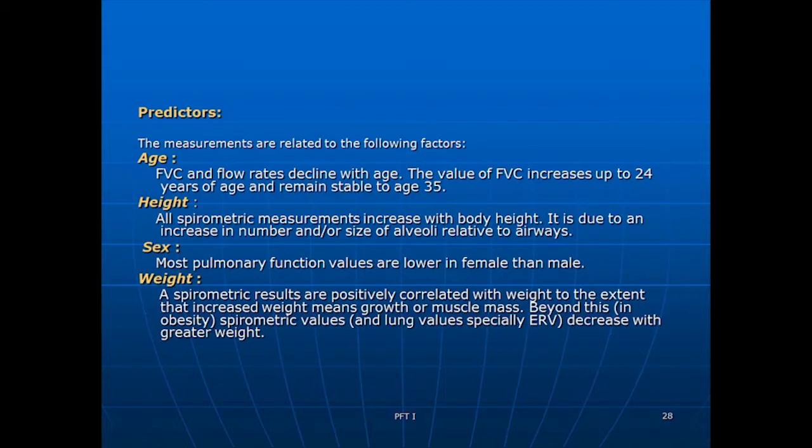Height, the taller you are, the higher your pulmonary function values are. Gender, males usually have greater pulmonary function values than females. Weight, the more weight you have, generally, the higher your pulmonary function values until you get to morbid obesity, and then your values decrease. And the last one that's not on here is ethnicity.